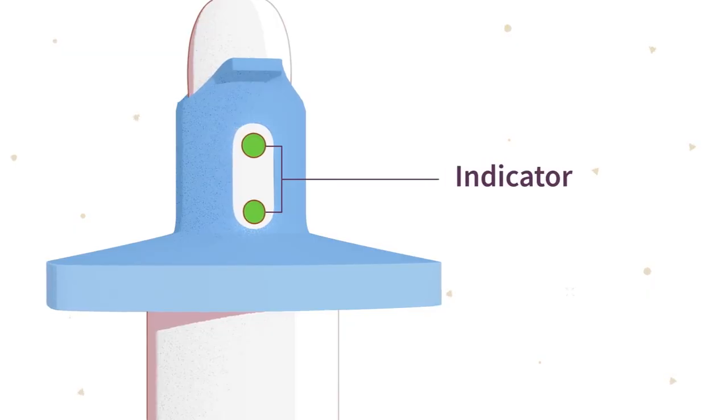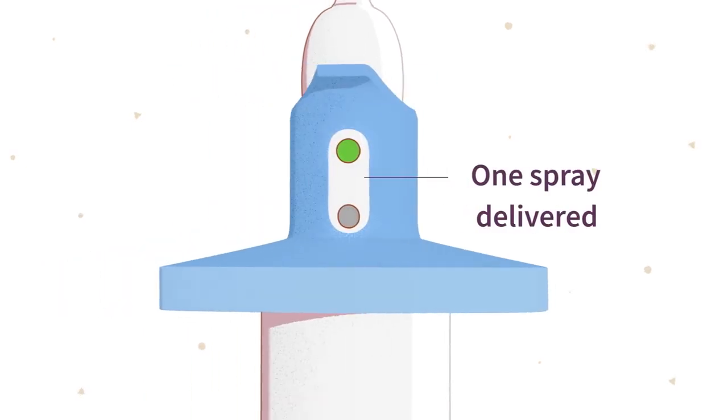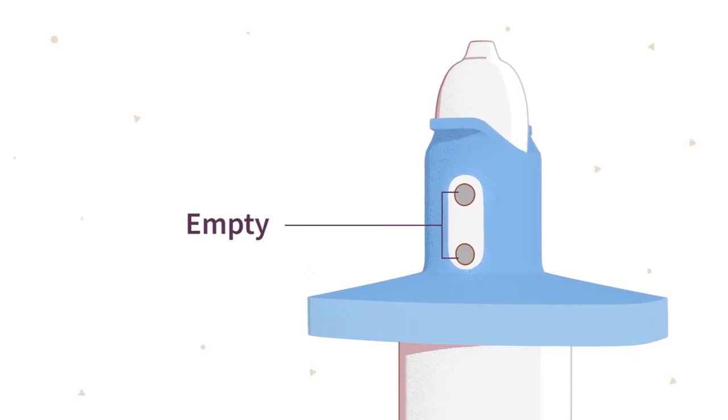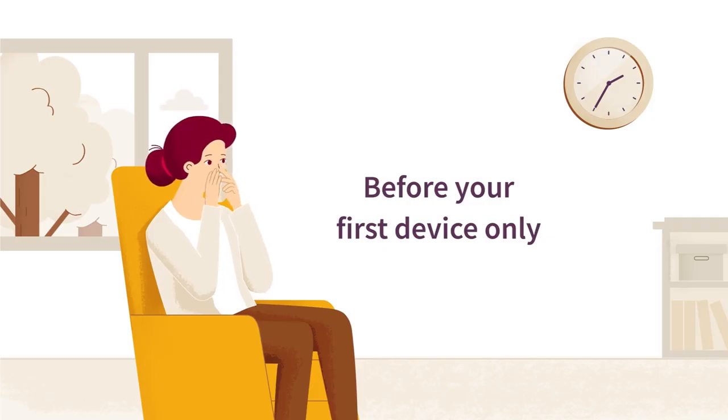Now let's look at the indicator window. 2 green dots mean the nasal spray is full. 1 green dot indicates that 1 spray was delivered. If there are no green dots, the nasal spray container is empty. Before administering your first device only, blow your nose to clear your nostrils.